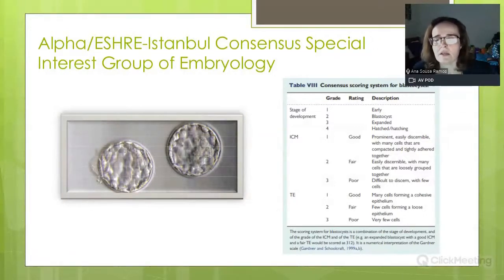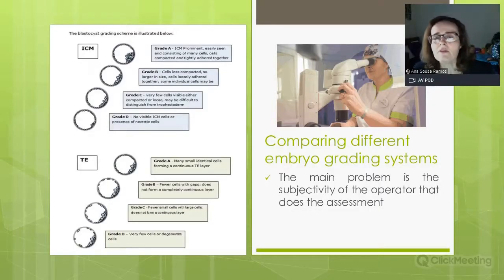And it helped us to classify all over the world. Usually in blastocysts, you already know, you use a grading system with 3 numbers. One for the expansion, the second for the inner cell mass, and the third for the trophectoderm. Nowadays, we can say that everybody in the lab knows this system. You can opt for another system, Sebir or whatever, but you know what this system means. It's international, okay?